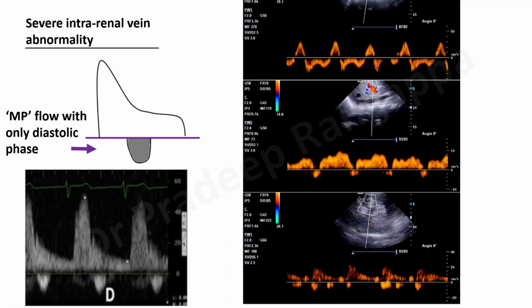It is not hugely pulsatile. I would say mild portal impairment, mild renal impairment, but hepatic veins is normal, because S is bigger than D. So those are the images.